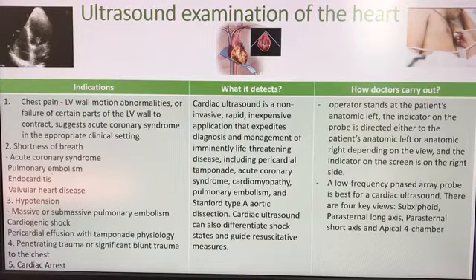And as usual, for preparation, patients should be lying supine on the stretcher with the head of the bed approximately 30 degrees upright. For males, the chest should be completely exposed, and for females, the hospital gown can be gathered at the level of the breast and towels tucked around the gown edges to keep it dry from ultrasound gel. Alternatively, a towel can be draped over this area if the patient is not wearing a gown.